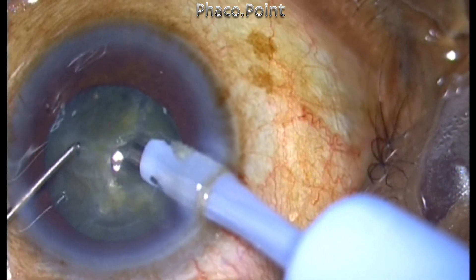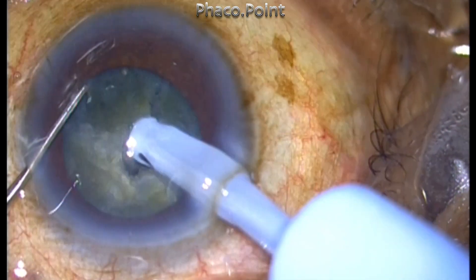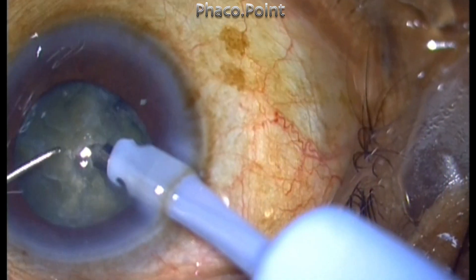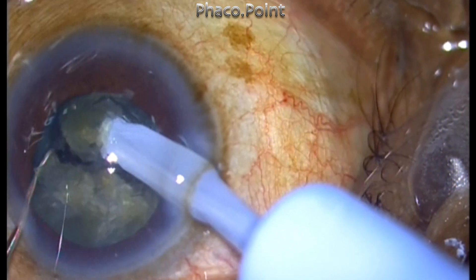I make multiple small fragments — it's not just four, even for a grade 2 nucleus sclerotic cataract. I attempt to make at least six nuclear fragments. The smaller the fragments, the easier will be the mobilization of the nucleus fragments.